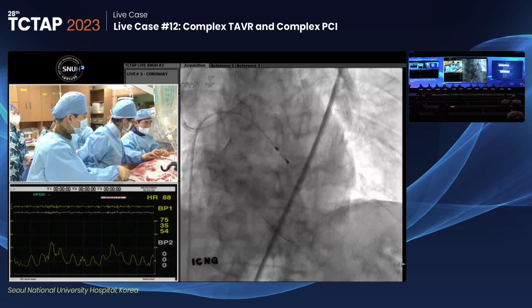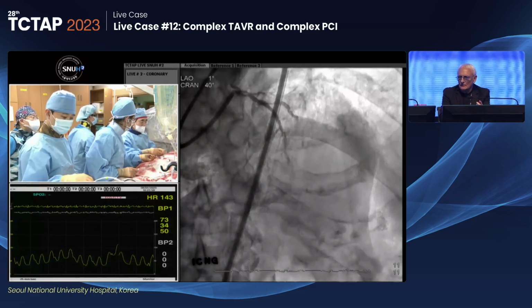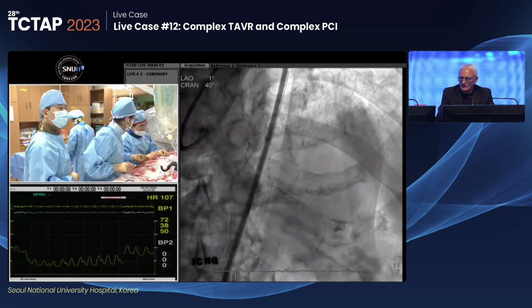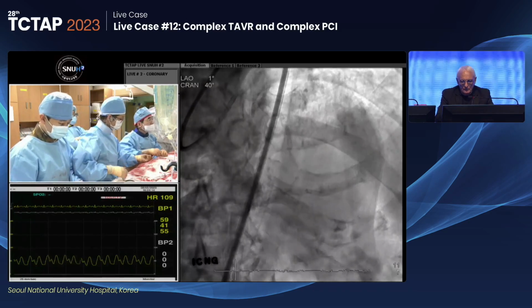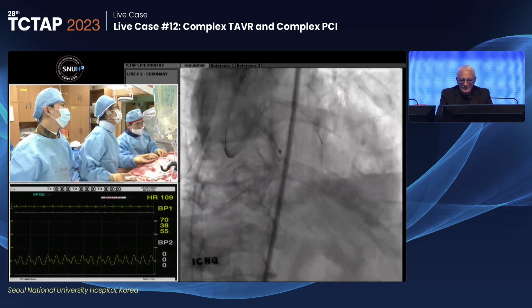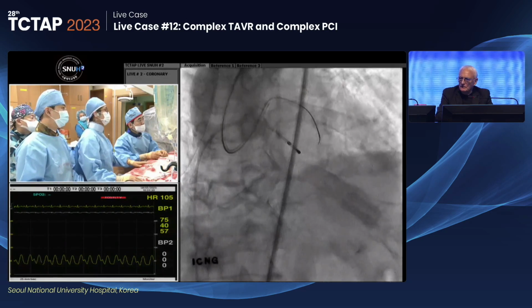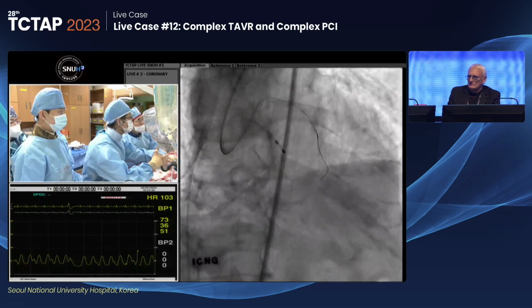The Pope's coming. I mean, the Pope's here. So we have a very difficult case that maybe you can enlighten us on a little bit, enrich our knowledge. It's very complex, probably one of the most complex I've seen for a long time. Calcification, 88 years old, and he has a very difficult time passing the wire in the LAD, very tortuous, right? The question was, Shockwave is out because it's not approved and wouldn't work here. So he's ballooning it, and the question was a laser. I remember we had some discussion about the laser.